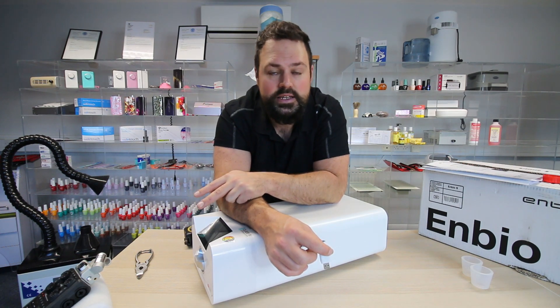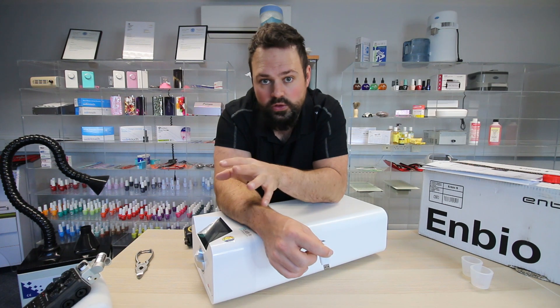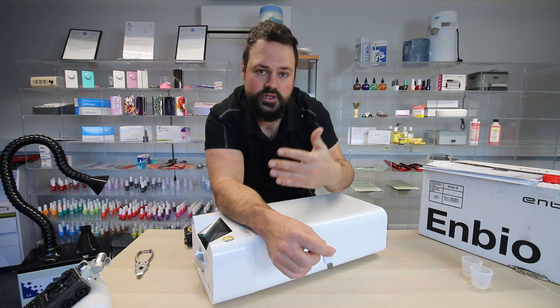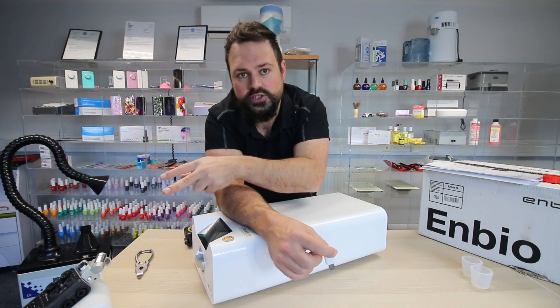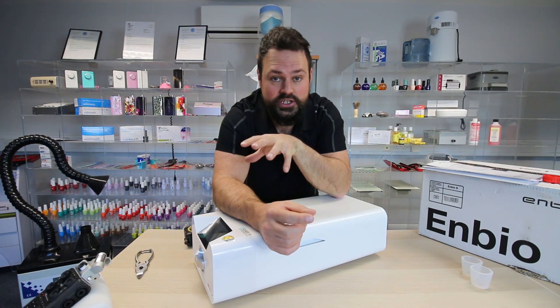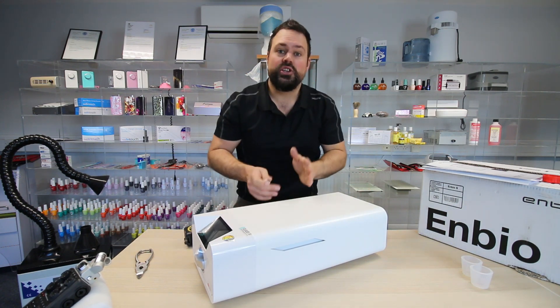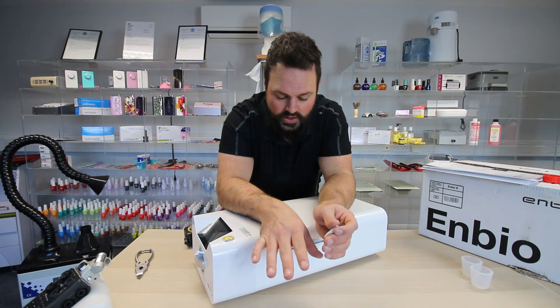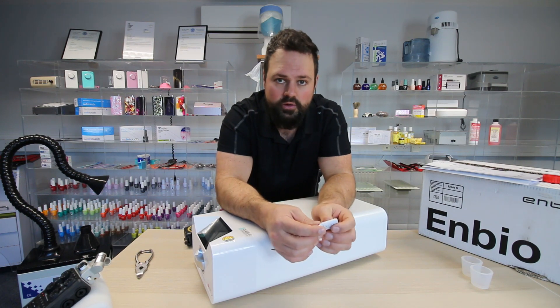Servicing ideally needs to be done every 1,000 cycles, which MBO roughly equate to about a year. The servicing we can do is a collection service — we collect it via courier, service the device here, and send it back via courier. It involves changing two seals: one inside the unit and one on the door seal. We'll also replace the HEPA filter and run two tests. We'll also carry out the written scheme of examination. Because of the size of these units, servicing can be done off-site, saving you from waiting for an autoclave engineer, and we can do it at a much more affordable cost.